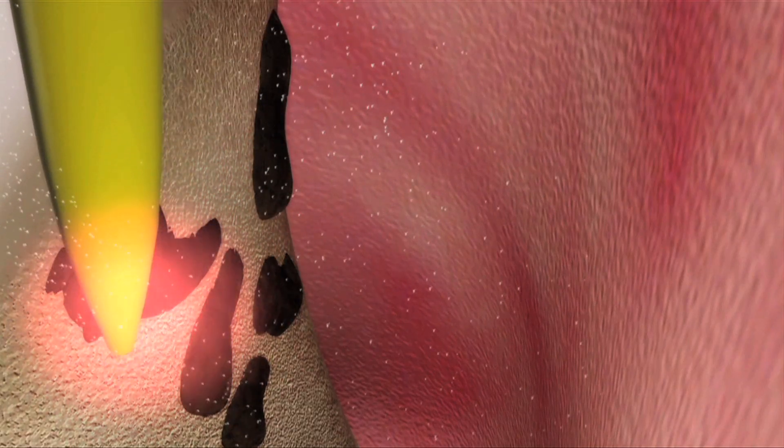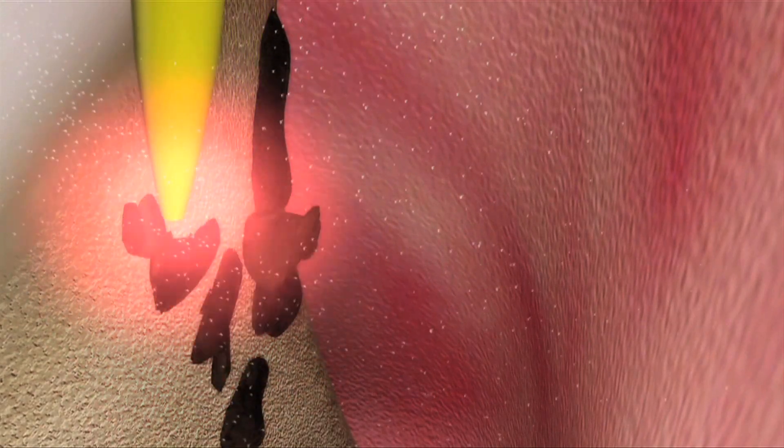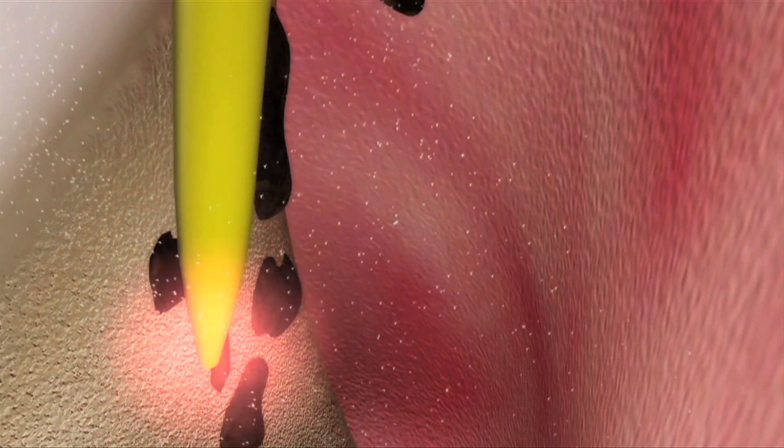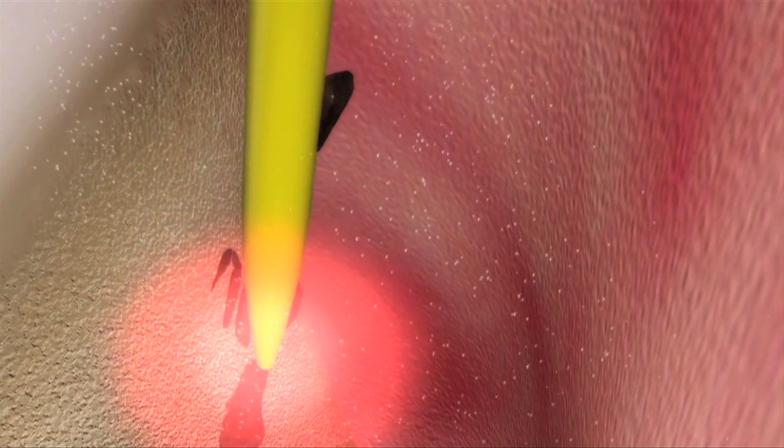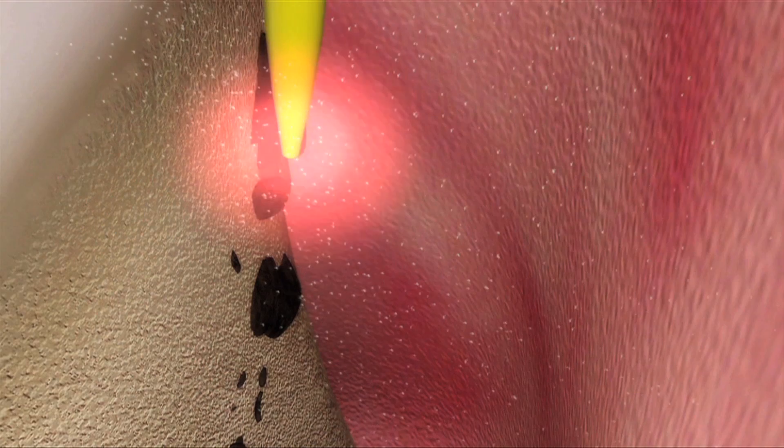With the laser firing, the tip is lowered along the root surface towards the bottom of the pocket until you feel a piece of calculus on the root surface. The Erbium YAG laser energy allows you to just tap it off.